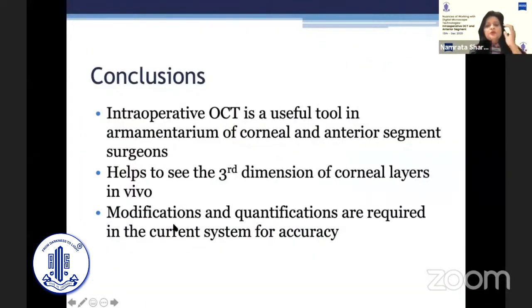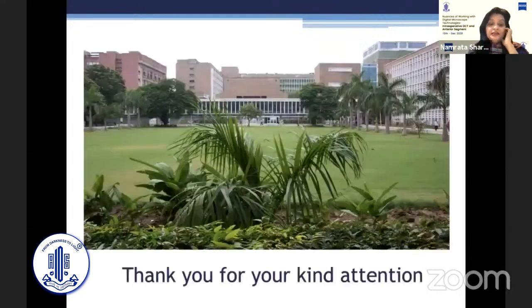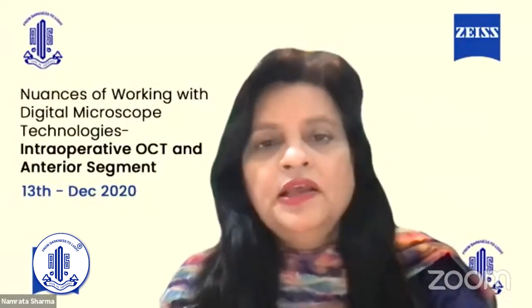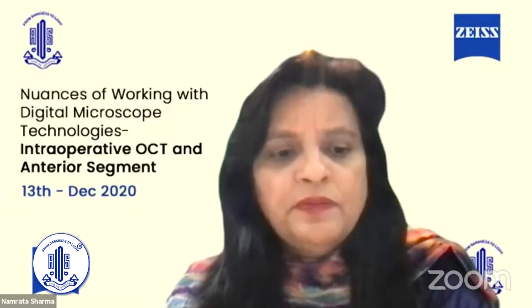So to conclude, intraoperative OCT is a useful tool in the armamentarium of corneal and anterior segment surgeons, and it's like a third eye. It helps you to see the unseen, and helps you to titrate all your steps in a much better manner.